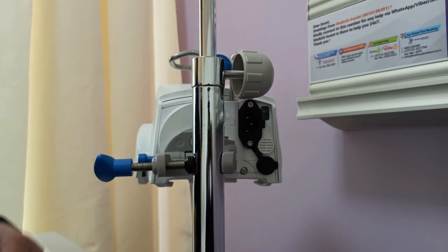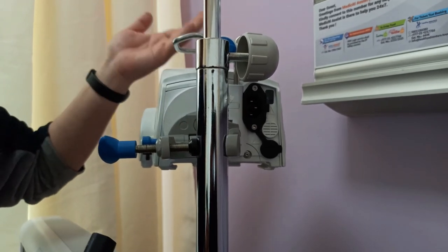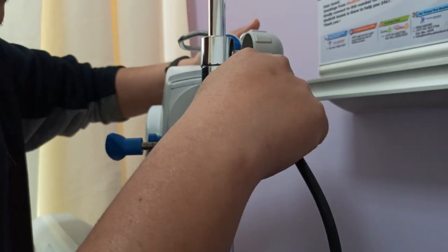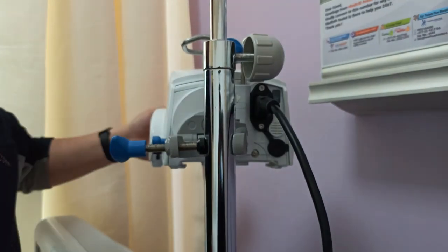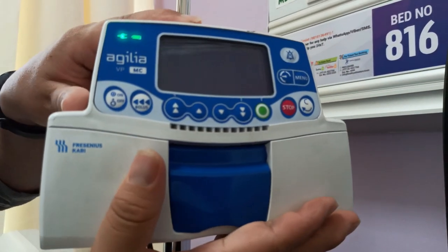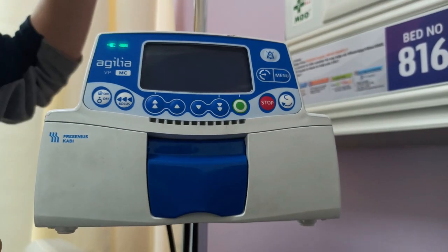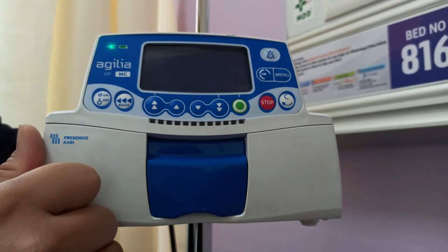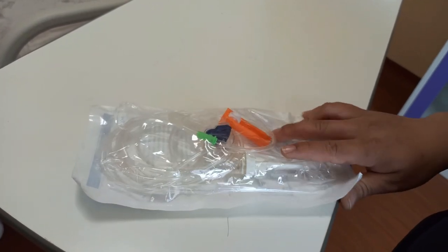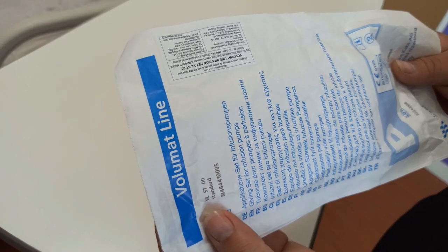We should always remember to operate this equipment with its power on. We put in the power inlet and we can hear a sound. When turned on, a light comes on — it is green. This is the Volumat infusion line that is compatible with our infusion pump.